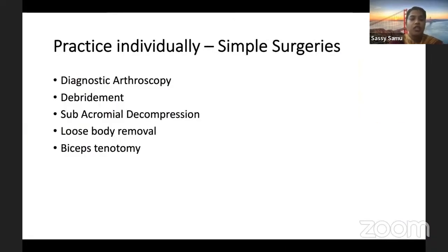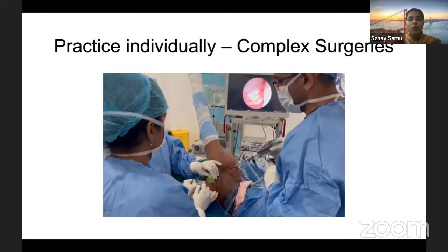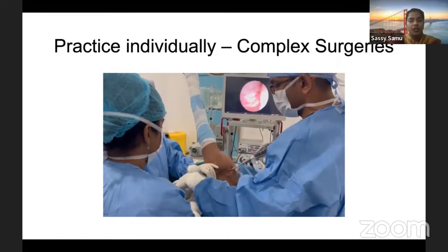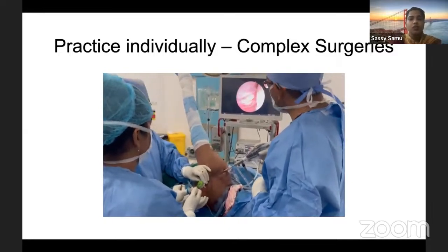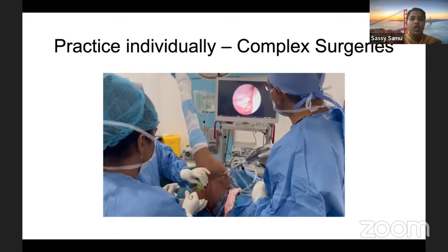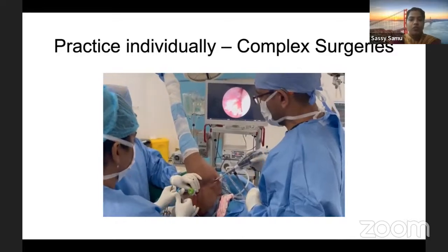When you start practicing individually, remember you have to start with a very basic step such as doing a diagnostic arthroscopy, master the steps and principles, and start doing basic debridements, subacromial decompression, loose body removal, and perform biceps tenotomy. And start getting access to more complex surgeries such as Bankart tear repair or a small rotator cuff tear. It's best to do this under supervision and get the niche of the surgical steps and get oriented until you become the master.